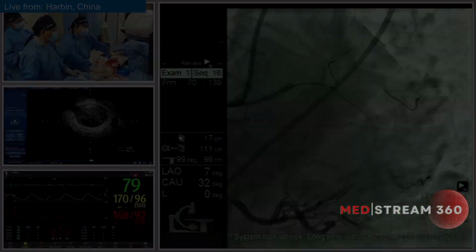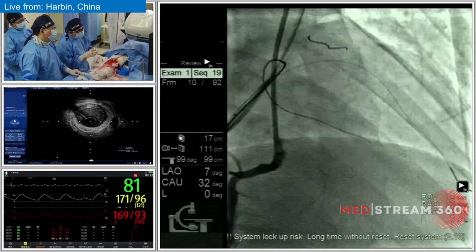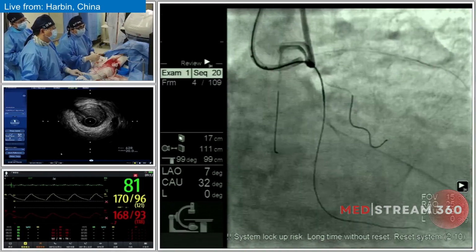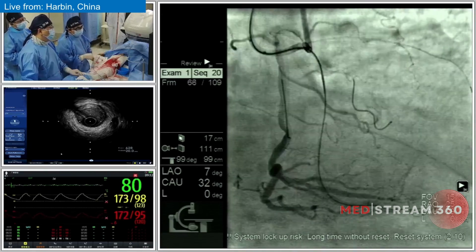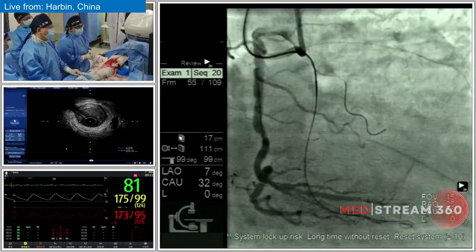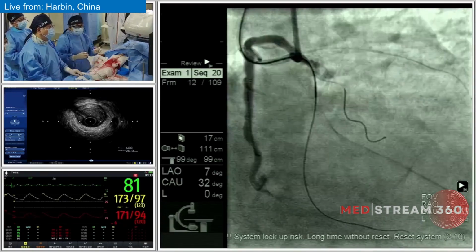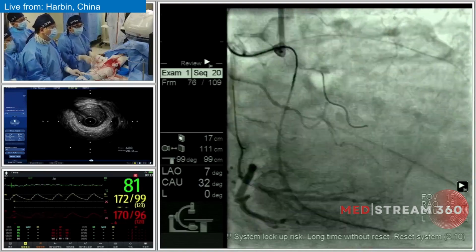It's kind of easy. When we encountered resistance, as the next step we exchanged the KDL, the dual lumen microcatheter, for the Corsair microcatheter to enter the occlusion segment to give the wire more support and enhance the penetration force of the wire.